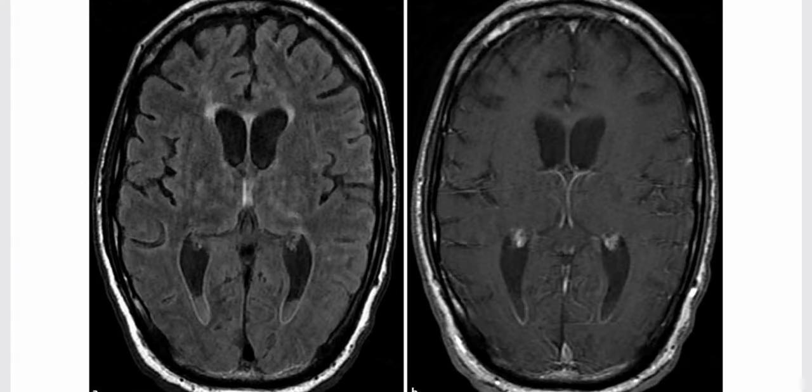So this is a case of a 42-year-old immunocompromised man presenting with headache, nausea, and vomiting. These are the axial FLAIR MRI sequences, and they show hyperintense signal which is layering in the dependent portions of the occipital horns of the lateral ventricles along the ependymal surfaces bilaterally and within the bilateral deep gray and white matter. On the axial post-contrast sequence, we can see that there is symmetric and abnormal ependymal enhancement posteriorly. Also, there is disproportionate parenchymal volume loss for the age of the patient.